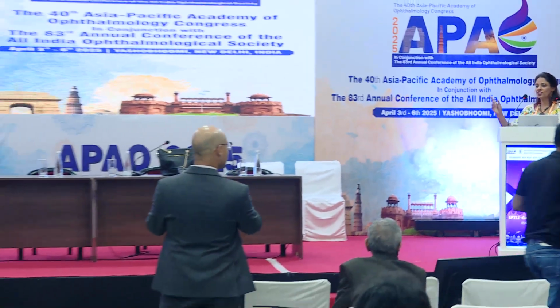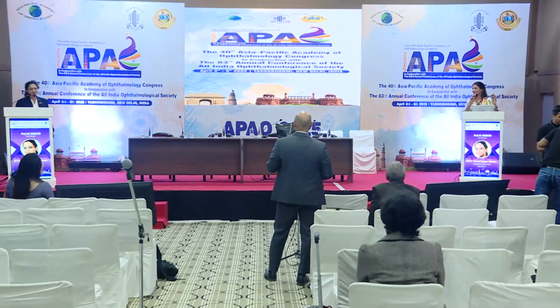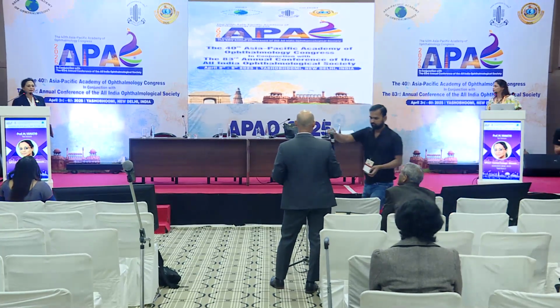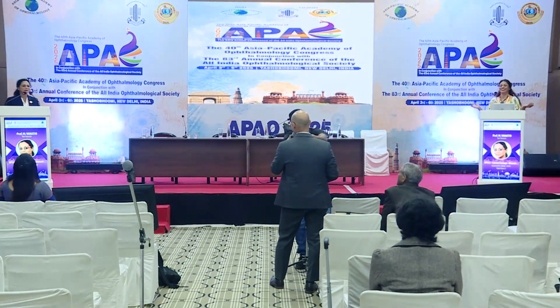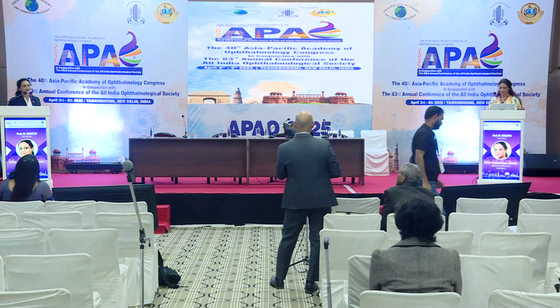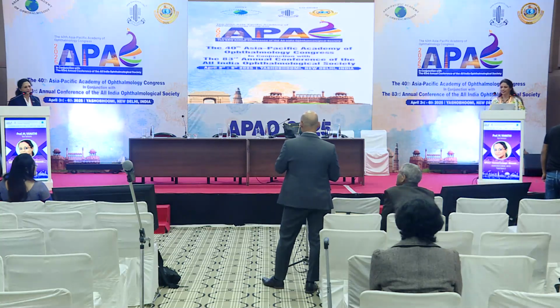That's what she told. She said that. I always do 3 months, yes. But I do see that's because probably we are all cornea people as well. But I see the cataract people are impatient even to wait for 3 weeks. I know. Yeah. But if you're planning to put a toric IOL, I think it's always definitely a good idea to wait 3 months. And the more the better always.